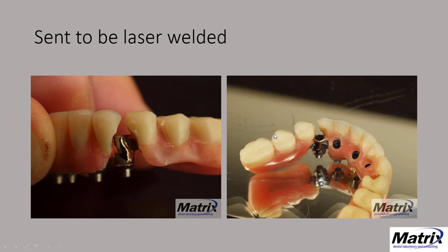Again, find yourself somebody who knows his stuff about laser welding. If you don't have one yourself, he can be a good benefit for you in these kinds of situations. Again, even though we have laser welded it, there is no warranty on this because this is a repair, and there are existing conditions which cause this to occur.